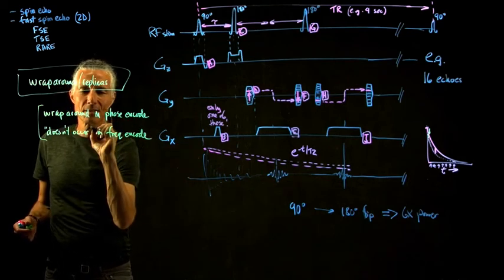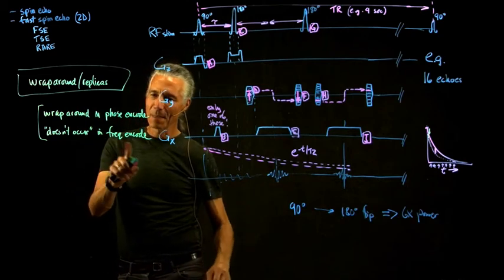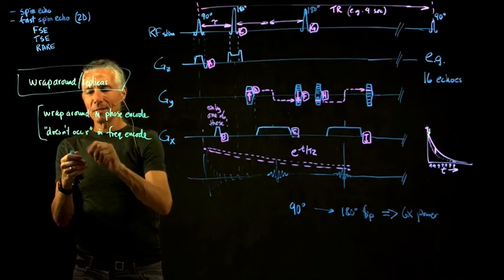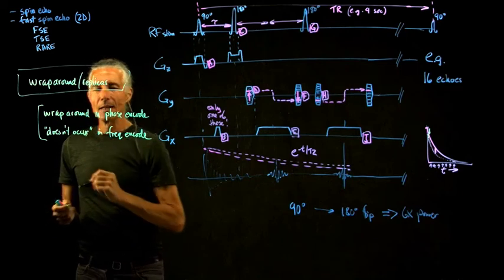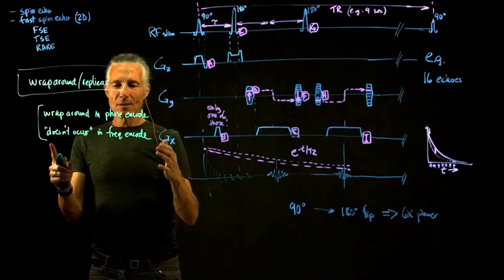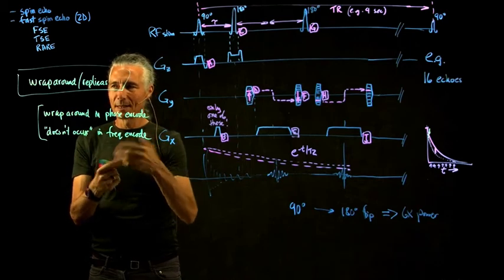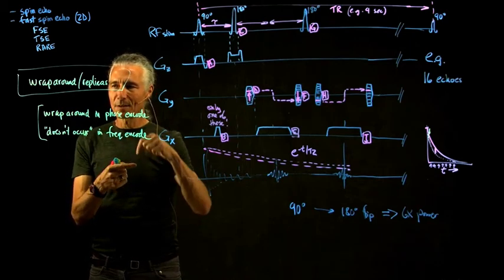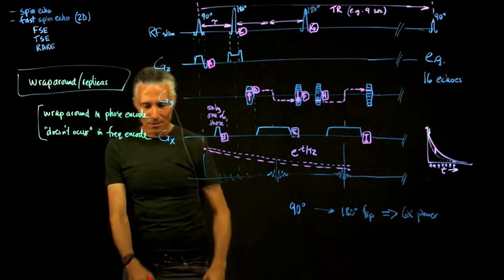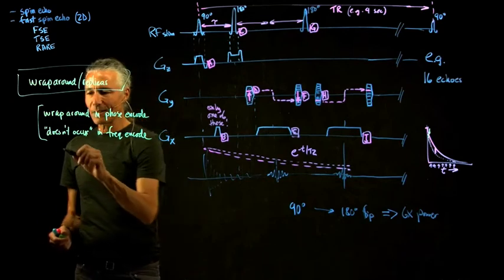you might think, oh, well, frequency encoding is fundamentally different. Didn't Marty say that frequency encoding and phase encoding were exactly the same? And they are. And wraparound does occur in the frequency encode direction. It definitely occurs just the same way because there are replicas in the frequency encode direction, there are replicas in the phase encode direction. The phase encode direction and frequency encode direction are just two equivalent dimensions of k-space that are only really distinguished by what direction the gradient is on. So how could it not occur in the frequency encode direction? And so the reason it doesn't occur, there's basically two ways to fix this.